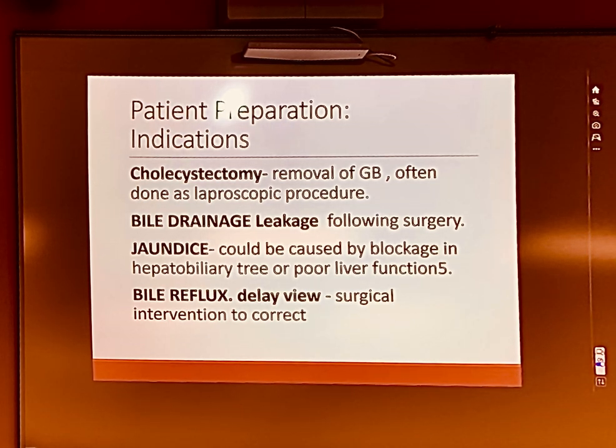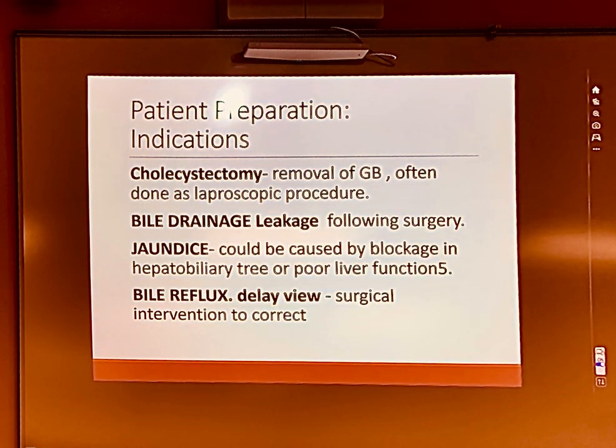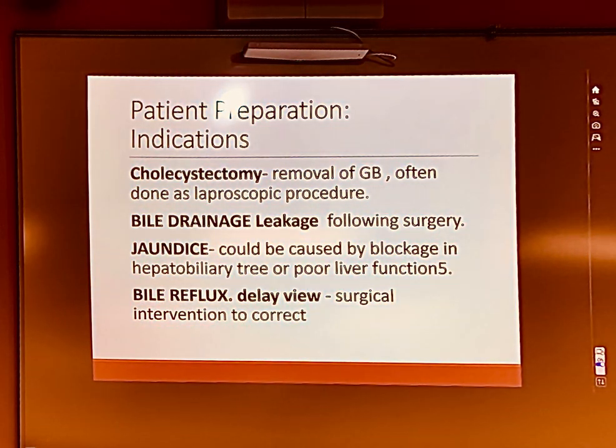Bile reflux cannot be controlled with medication or anything like that. It is usually a surgical problem, which requires a surgical solution. Okay. You also need a delayed view, meaning maybe a 24-hour picture or a 6-hour picture.